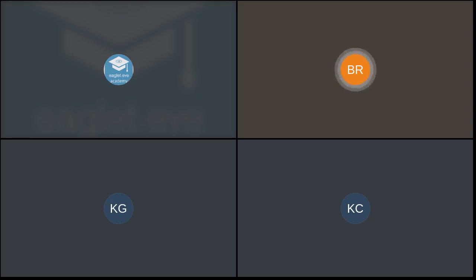Boston Sight kind of does that already with their fit sets being toric in nature, but the Eaglet takes it to the finish line with whatever company you use, or really the one and dones with Boston. As you can see with my example, it was very close off that first design. But if I would have ordered it with the Eaglet, with it all together, that was a one and done lens.